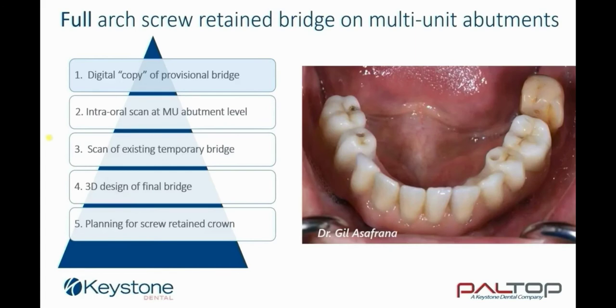In this case, the existing temporary bridge could function as a template for the final bridge design. Using intraoral scanning, it was possible to record abutment position, soft tissue, pre-preparation scan, in this case the scan of the temporary bridge, the opposing arch, and the bite registration.